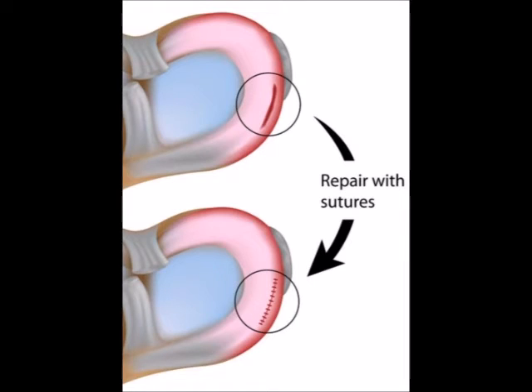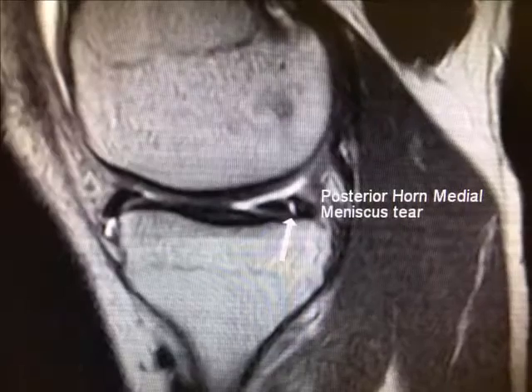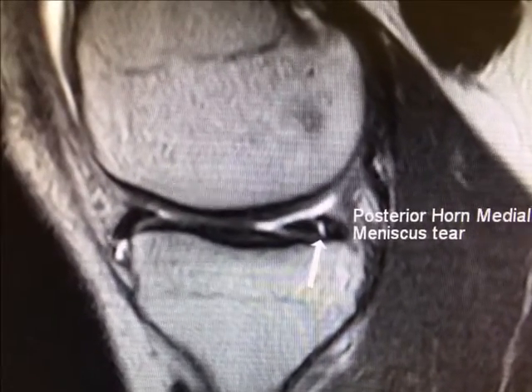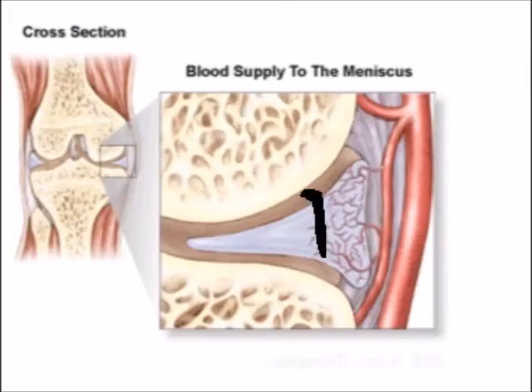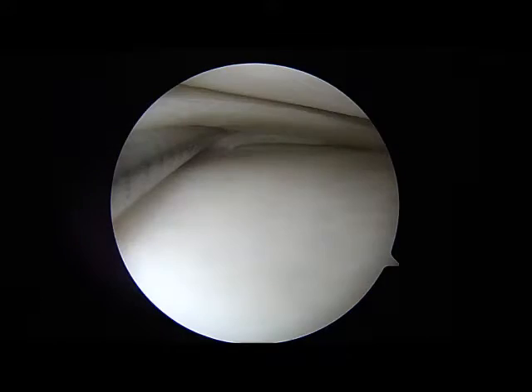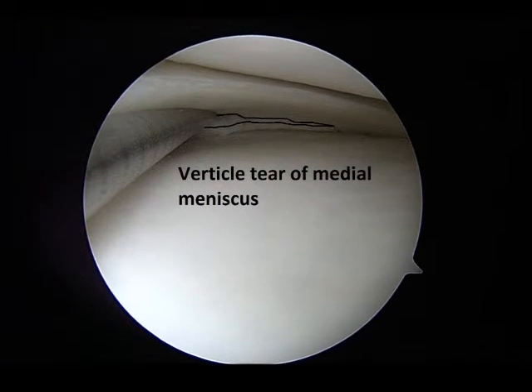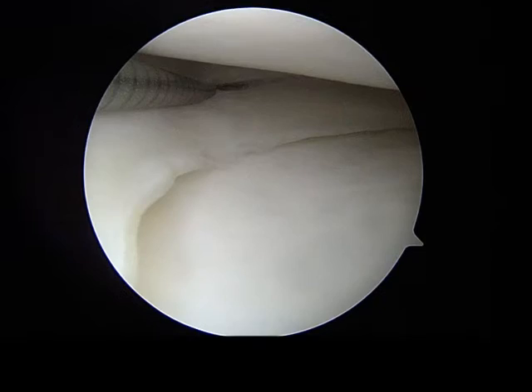The first procedure I will be showing is a meniscus repair. The vertical tear I will be operating on was located within a vascularized zone of the meniscus. As you can see on this patient's MRI, the tear is located within the thicker area of the meniscus and had a simple vertical line. The surgical evaluation showed that the tear was indeed a vertical pattern and located within the thicker portion of the meniscus, which is the vascularized zone. I used my surgical probe to evaluate the tear location and size.